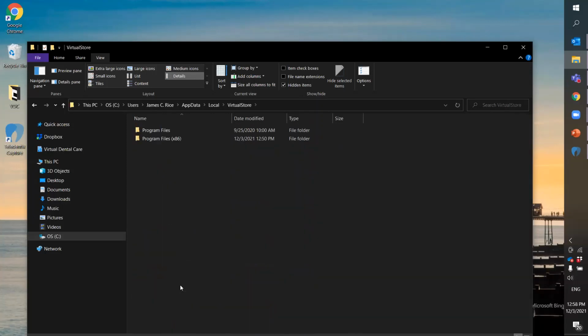Now, I know it can be a little intimidating getting in here to the plumbing of the computer. If you have any questions or concerns, just let myself, Fabi, know. We're happy to set up a time to go over this individually and get it all smoothed out for your machines. With that in mind, I'll pass it back over to you, Fabi, to clear up the rest of the presentation. Thanks. Thank you so much.